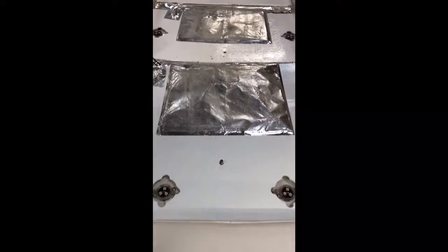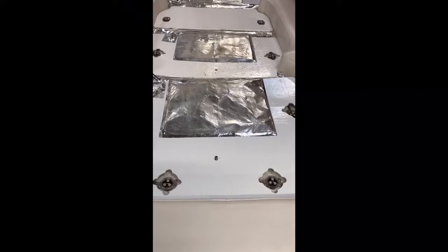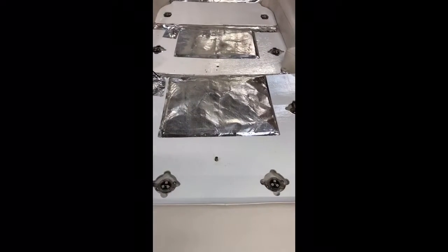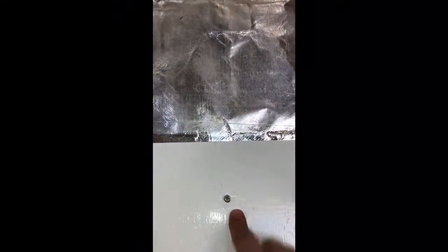All right, today I'll be showing you how to do some troubleshooting on the DX Multi table, the water bed. First, we're gonna go ahead and take off the screw, this part here. Once the screw is off, the cover, you can go ahead and remove it.